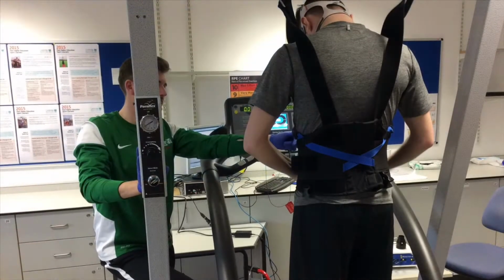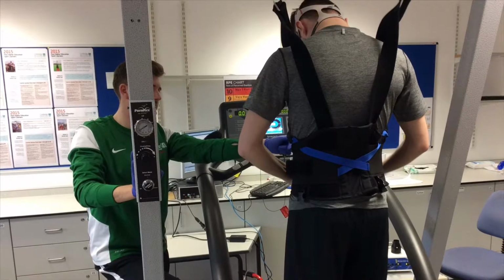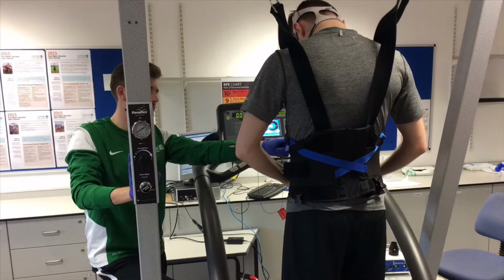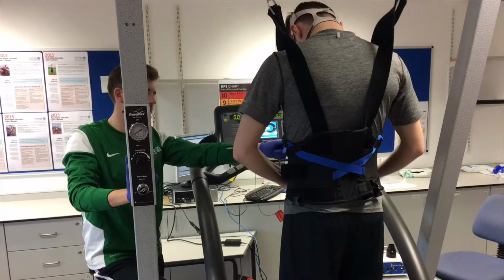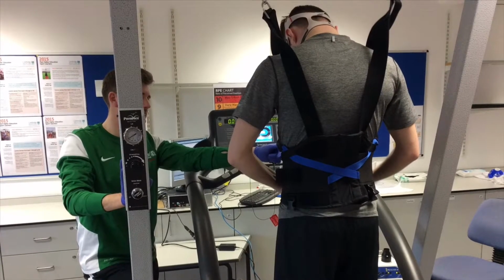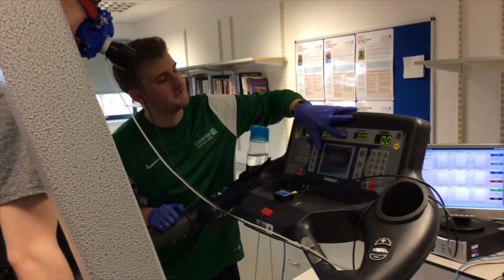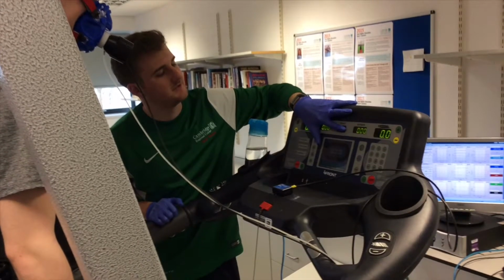To ensure the client is safe throughout the whole test, a harness was used. According to Shoemaker and Woollacott, 2007, a harness is used in combination with a treadmill as it provides body weight support and can prevent sudden falls or trips whilst running. Here the client is being told what each figure on the dashboard of the treadmill stands for. This will give the individual more information about what they are doing.